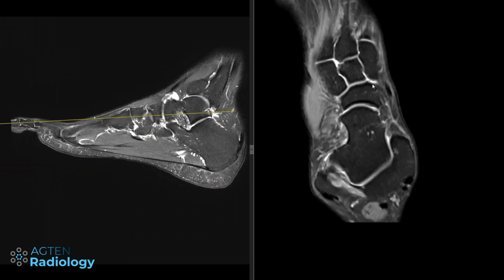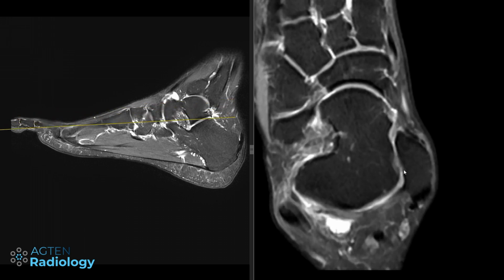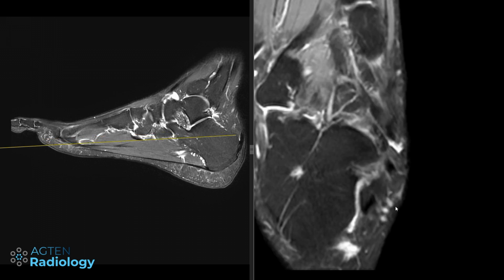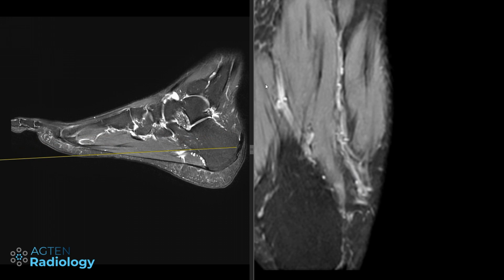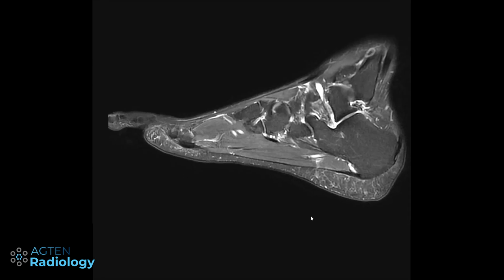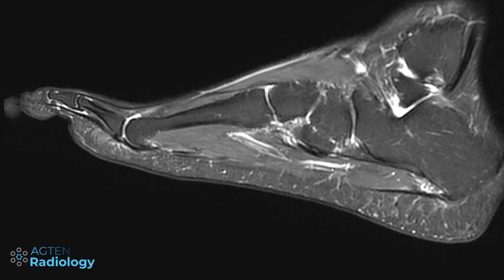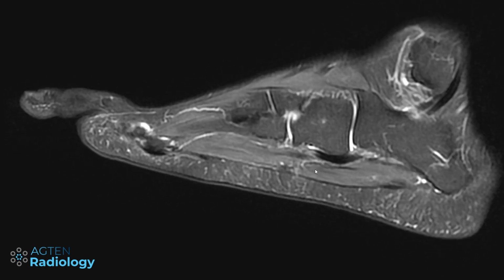Now here we noticed, first of all, there is less volume of the veins. You can see this PD fat-saturated here. There's no flow void really. And then down here we can see there's no occupying lesion, as I call it, within the vessel here in the veins. Even on the sagittal, when we go large here, and then maybe to the lateral side, because that's just the more prominent vein. So this is where we previously had the thrombus here.